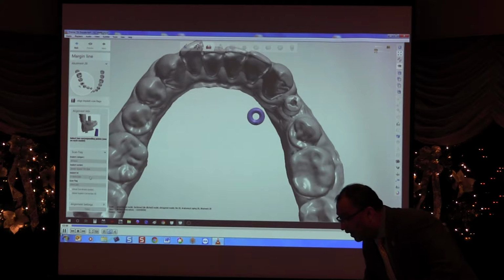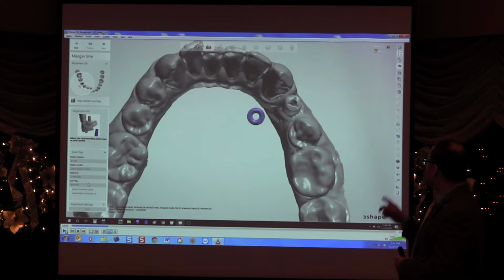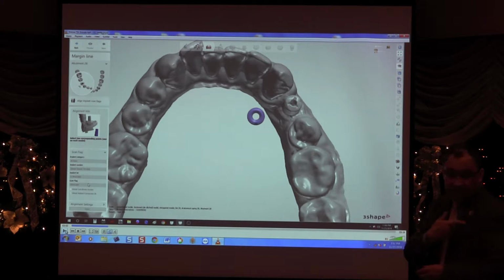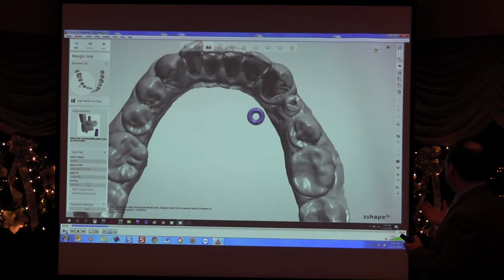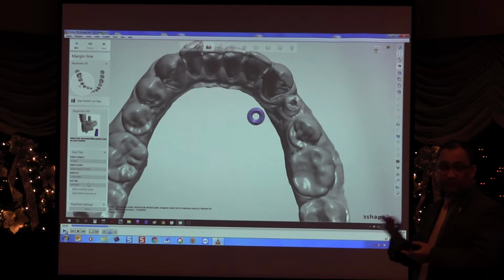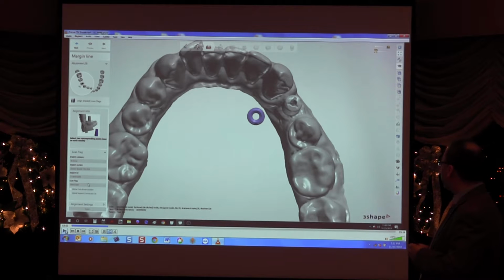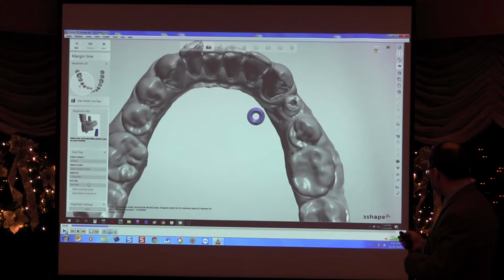So this is the time where I often call Dr. Martin, because sometimes, as he said, the scan body is sitting right at the tissue level, and we're not sure, so we usually call Dr. Martin to verify if those two scan bodies are lining up. So this blue scan body is actually a digital scan body in our system. So these two have to line up in order to get the timing of the implant and the vertical position of the implant.